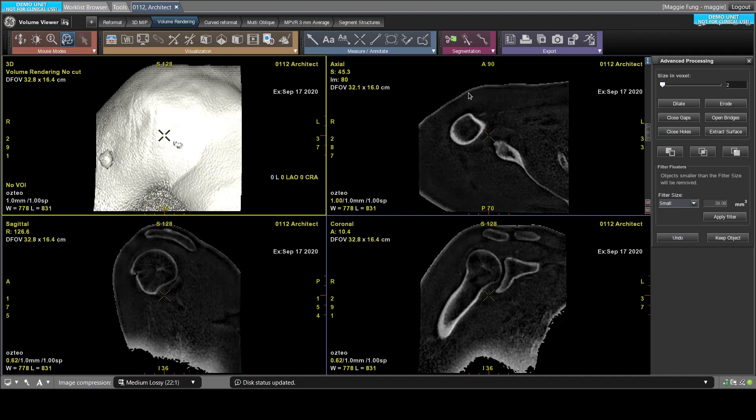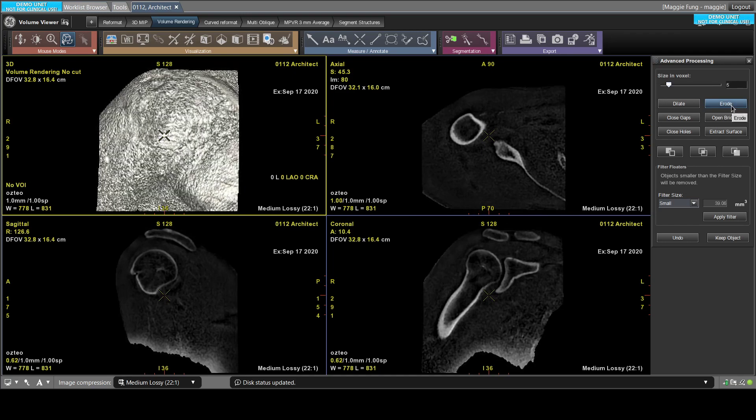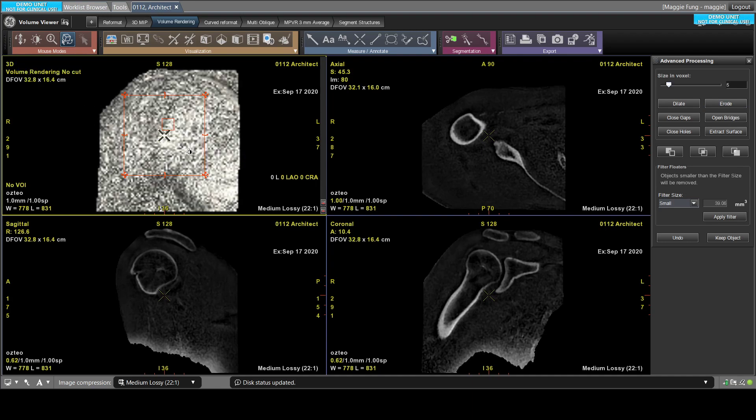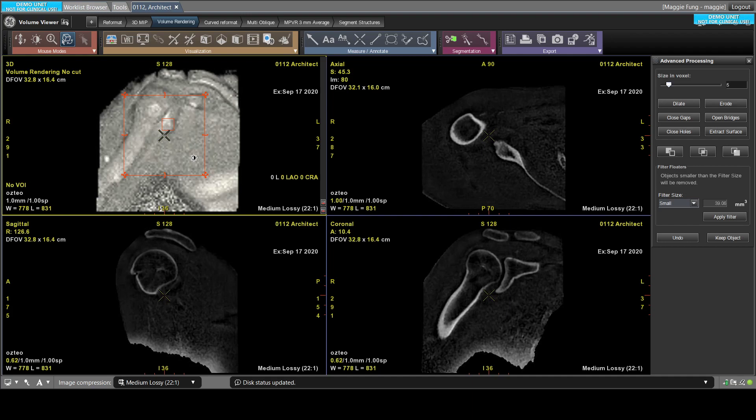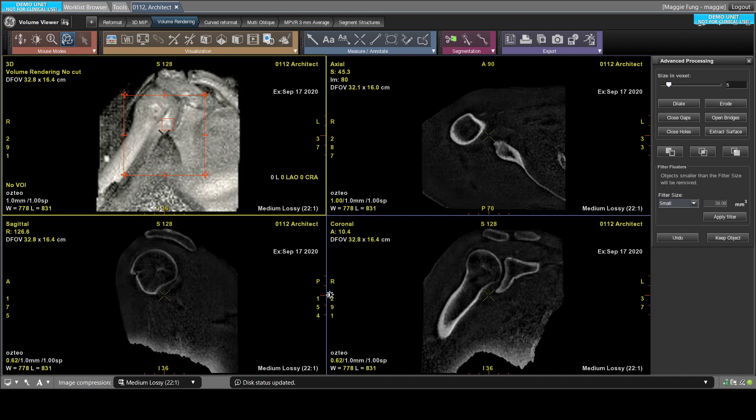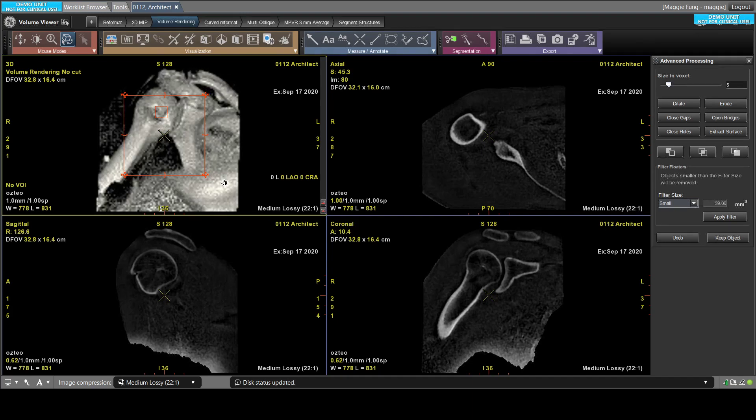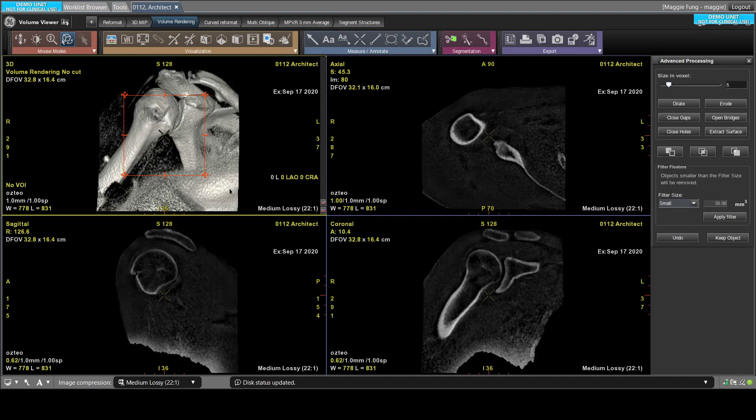The next thing is you want to get rid of some of the skin. So for shoulder, usually I use 5 pixels and say erode. And now you're ready to use the middle mouse to do window leveling in the 3D volume rendering viewport. You just use the middle mouse to adjust the window leveling so that you get to a nice volume rendering view that you want.